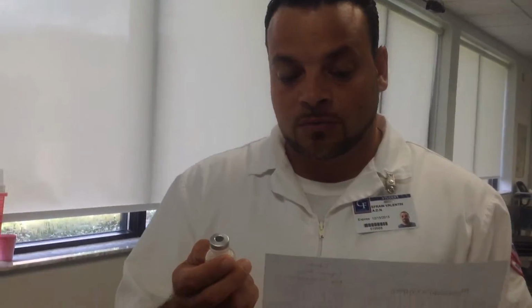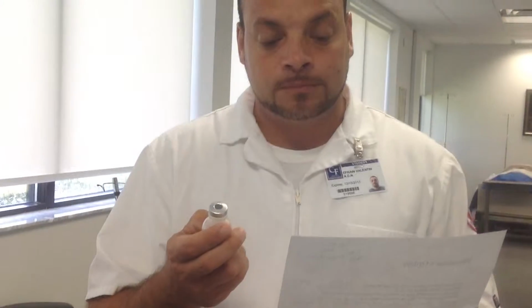After carefully reviewing my patient's orders, I have to administer hydroxyzine or Vistaril, 40 milligrams IM, and I have the medication here, and the medication bottle is labeled 50 milligrams per mL.